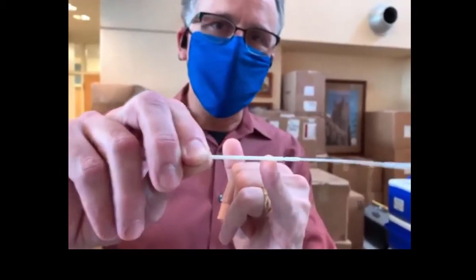The other thing to notice is that there's a little indentation on the swab. This is the point where it gets snapped off, and it's very easy to snap it off.